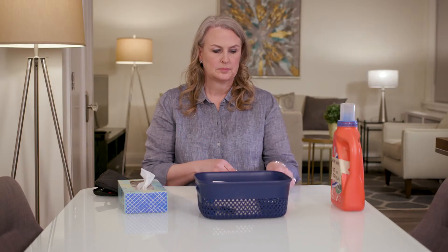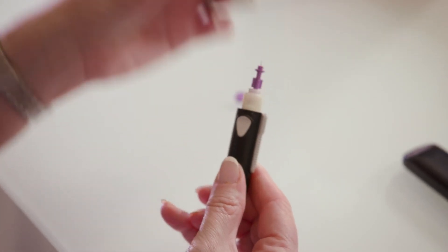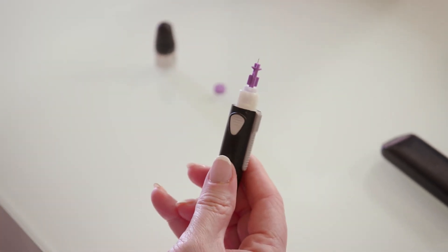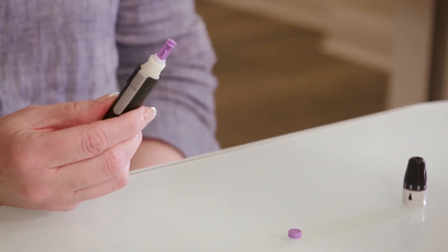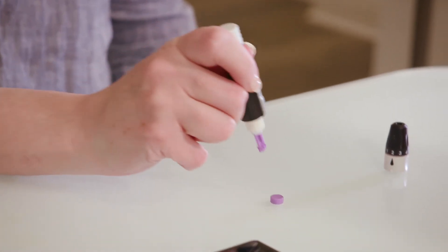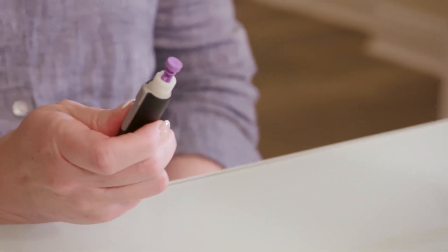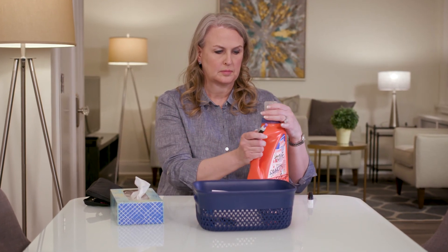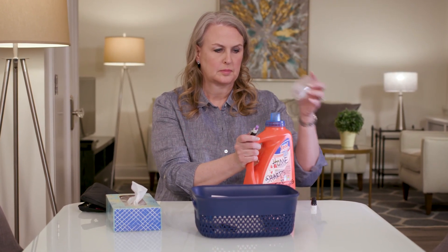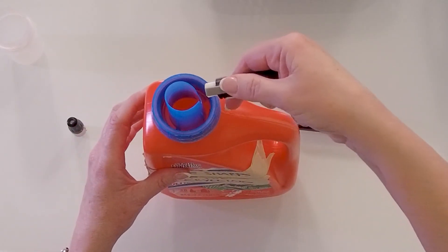To remove the lancet from the lancing device, twist the white band to unlock the end cap and pull it straight off. Put the round plastic tab you removed from the top of the lancet earlier on a flat surface. Stick the end of the lancet firmly into the plastic tab. This covers the needle so you won't accidentally poke yourself. Holding the lancet device over your sharps container, slide the gray lancet ejector forward until the lancet falls into the sharps container.